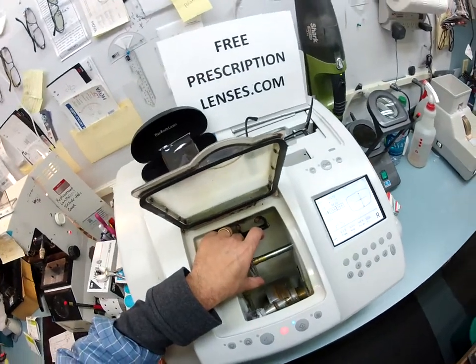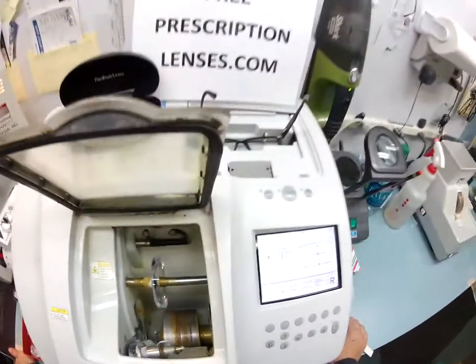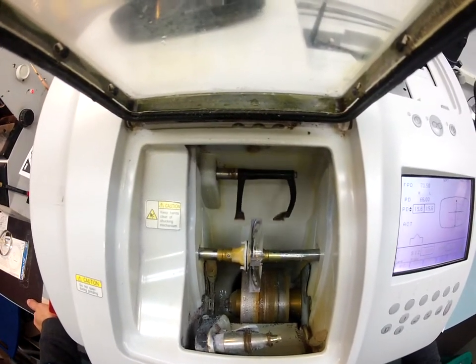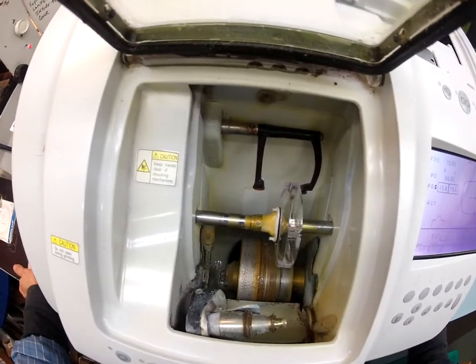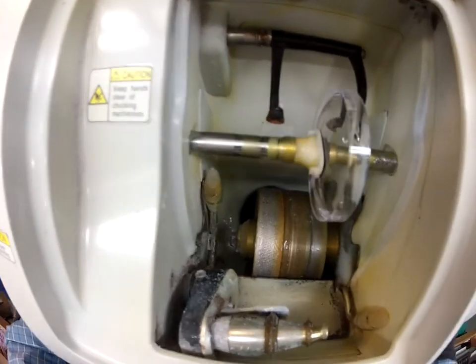So I'm going to hit start. The first thing that's going to happen is the LMU is going to come down and trace the shape of your frame onto the lens. First it's going to trace the concave side of the lens, and then it's going to trace the convex side. The concave side is closest to your eyelashes. The convex side is away from your face.